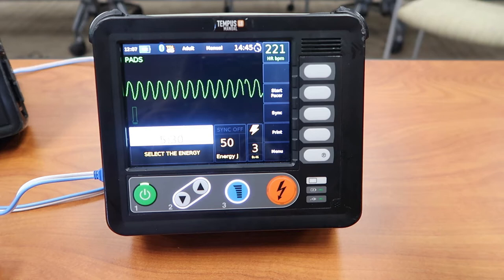Today I wanted to go over how to cardiovert with a Tempus. Just to be clear, I was not filming on a live person. A Simbio was used to produce the rhythm, and the scenario that I'm going to use is completely made up. The rhythm that you're currently looking at, as you probably already know, is ventricular tachycardia.